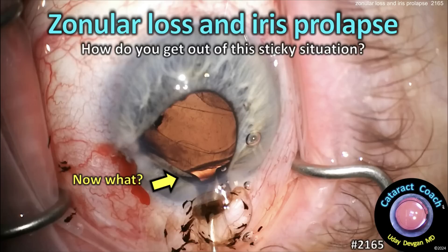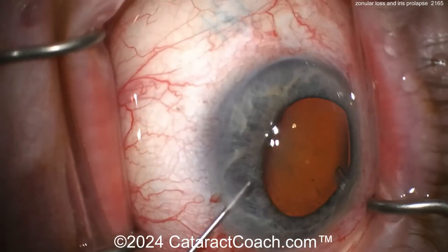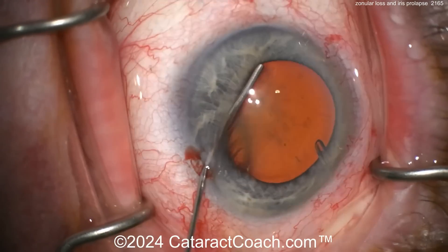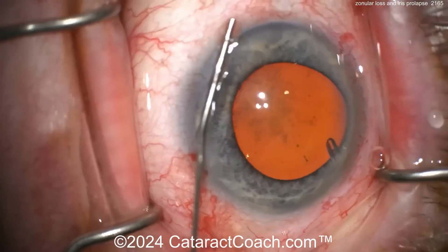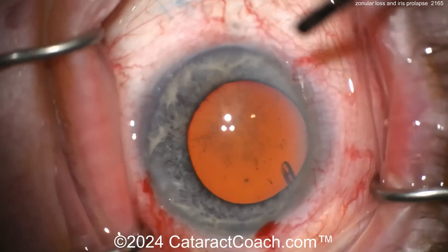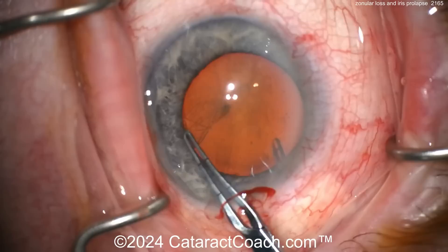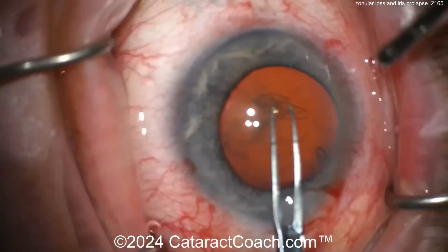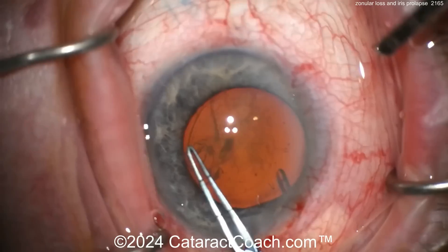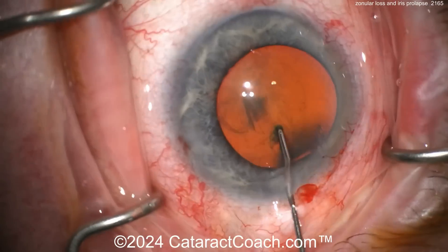Cataractcoach.com — zonular loss and iris prolapse. Wow, how do you get out of this sticky situation? It's a very tough case. You can see the patient has some synechiae, prior history of uveitis, and what looks like an Ahmed valve or some sort of glaucoma tube there as well. The main incision is being done. Now getting the rhexis done — I like how the rhexis is centered up on the lens even if the pupil dilation is asymmetric.